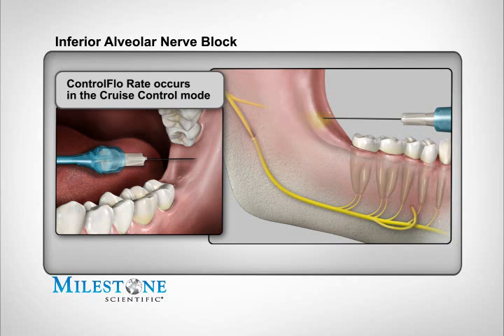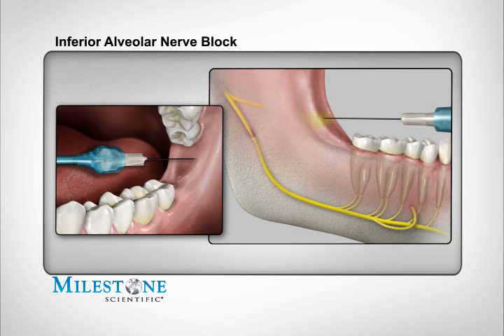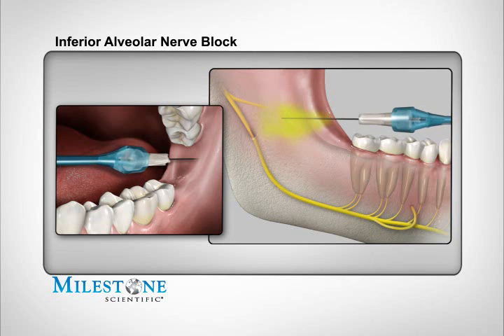tip of the needle. The technique of creating an anesthetic pathway requires a very slow and deliberate needle movement, allowing the anesthetic solution to deliberately precede the path that the needle will take. Slowly advance the STA handpiece while simultaneously rotating the handpiece using a back and forth motion. This is called the birotational insertion technique, and it will minimize needle deflection, resulting in more accurate placement of the needle tip to the intended target.